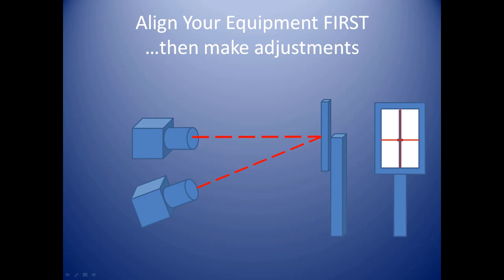Before you bring your patient into the room, you want to do as much preparation work as possible. That includes inputting your patient demographics into your digital system, or making sure your paperwork is in order. You'll also want to input your techniques for the first examination — whether that be an AP and a lateral — and make sure that your camera is lined up with your upright bucky. We'll be utilizing the upright bucky for this series.